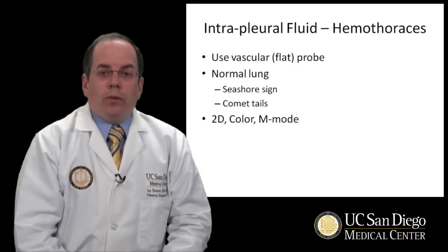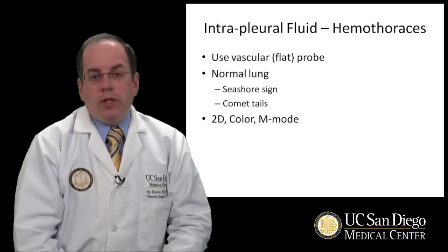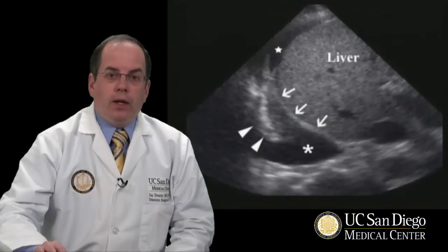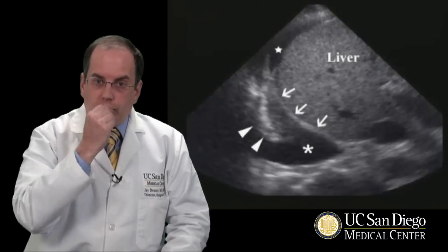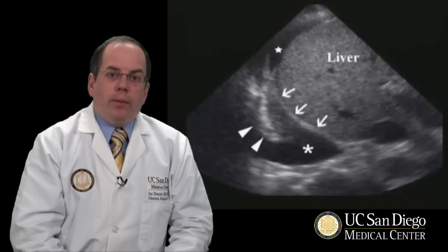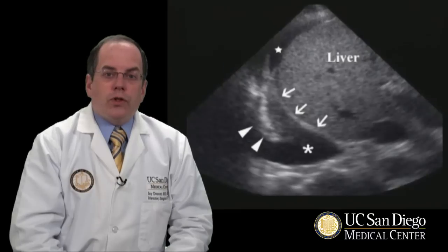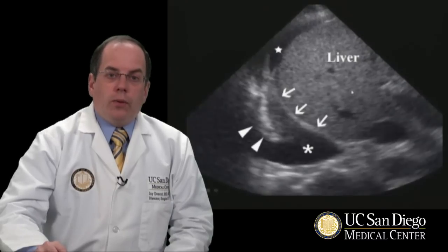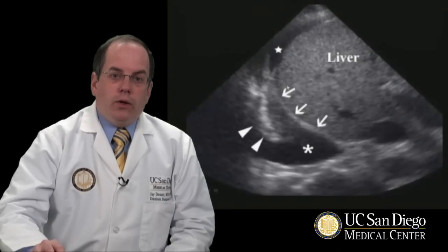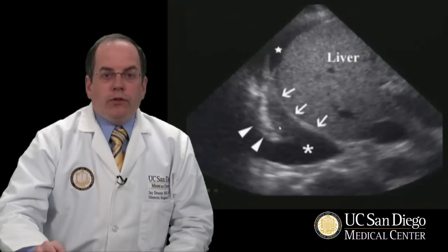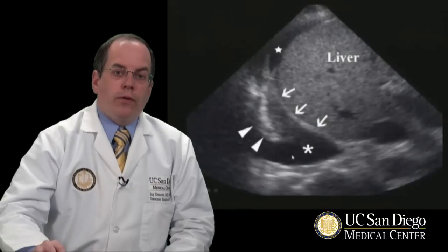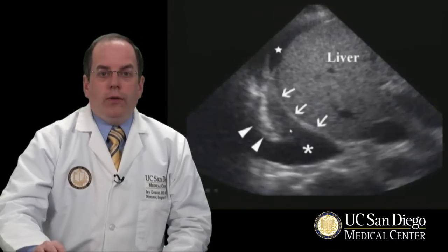There are two findings in the normal situation. One is called the seashore sign using M mode. The other one is called cometails using 2D. Here's an example of fluid seen above the diaphragm using a right upper quadrant view, just higher than Morrison's pouch. The liver is this large granular object with the ducts seen within it. The bright line here is the diaphragm. The lung is not normally very well visible in ultrasound, but when it's surrounded by fluid and collapsed, you can see that there is black fluid above the diaphragm and around the lung. This is a hemothorax. There's fluid seen on both sides of the liver here.